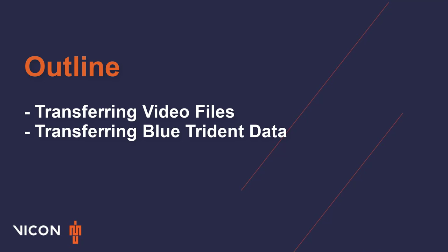This video assumes you have already collected data, which includes reference video and or IMU data. If you would like information on capturing data, please see the capturing data tutorial.